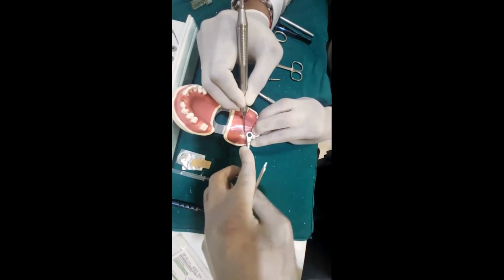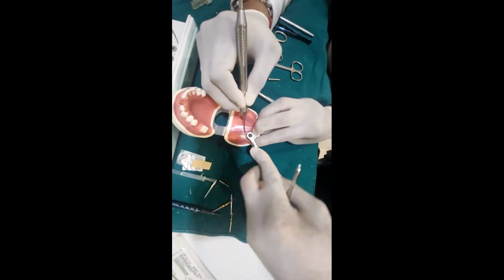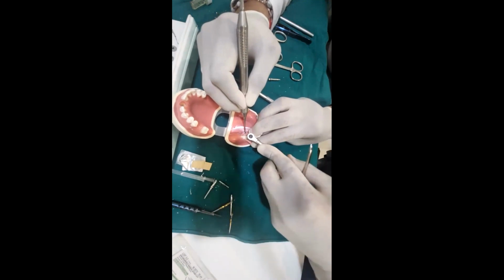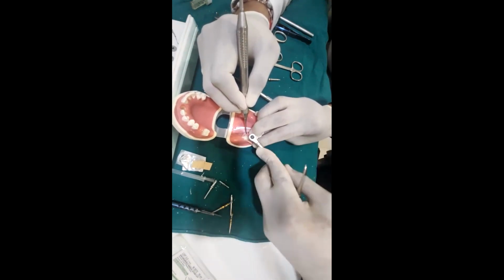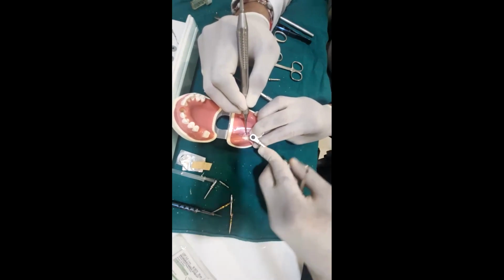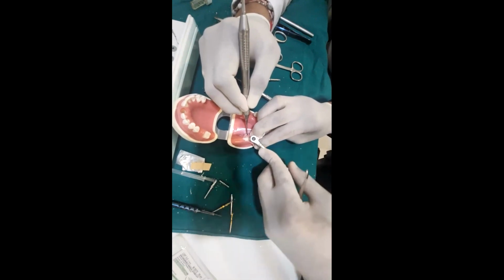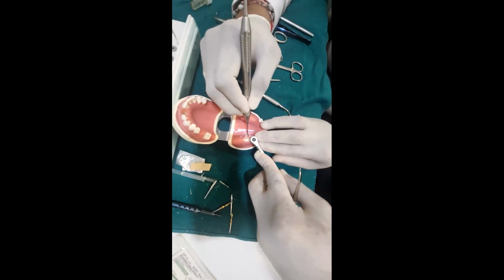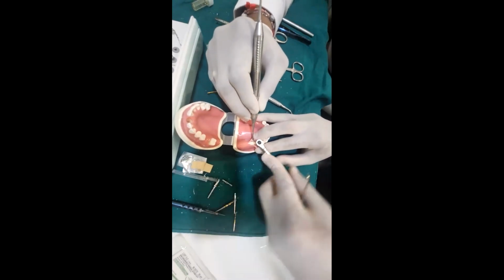You don't want to cause overheating over here. You should also ensure that you are not using too much torque in the patient's mouth, because that causes pressure necrosis. This is as good as the patient shouting, "It is hurting," if it is so tight.